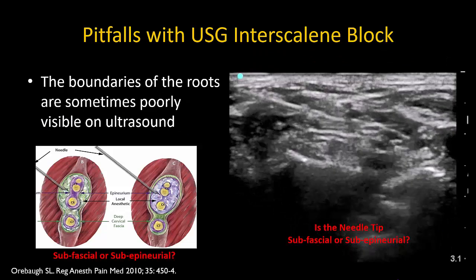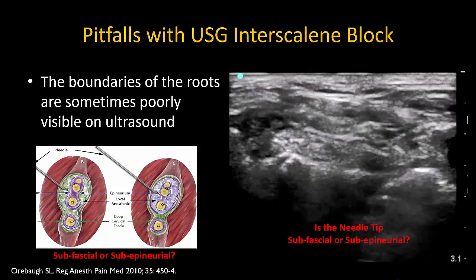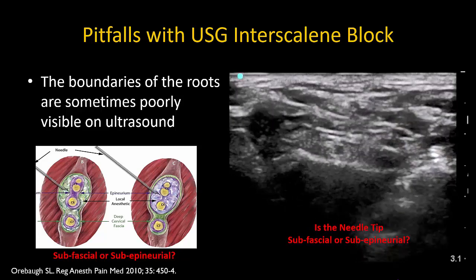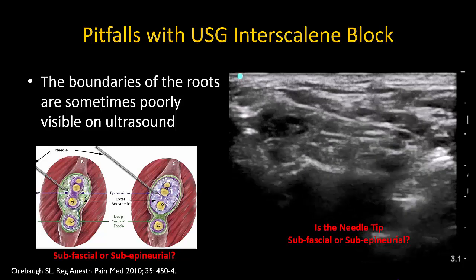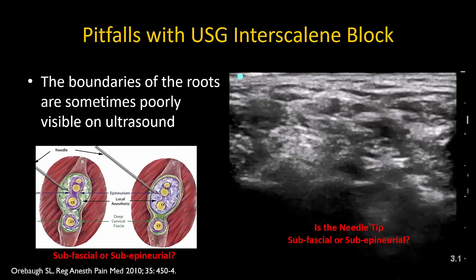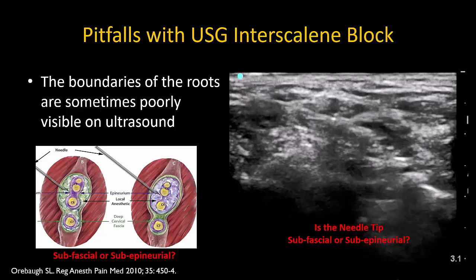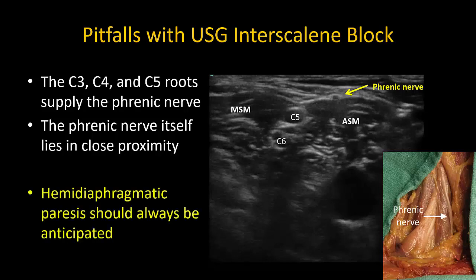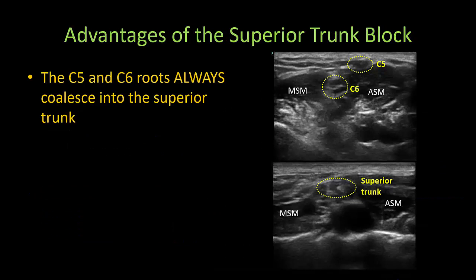This video of an interscalene block illustrates how difficult it can be to get a good image of the roots in the interscalene groove, making it difficult to ensure the needle tip is not subepineural and that injection is not inadvertently intraneural. The C3, C4, and C5 roots give rise to the phrenic nerve, which lies on the anterior scalene muscle in close proximity to the C5 and C6 roots. Hemidiaphragmatic paresis therefore almost always results from interscalene block and should be expected when making a clinical decision to perform it. The superior trunk block addresses many of these pitfalls.